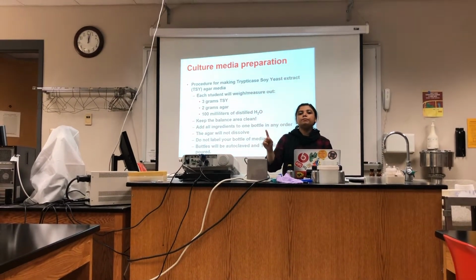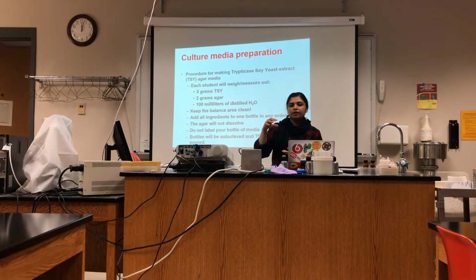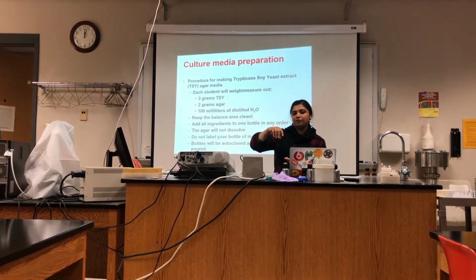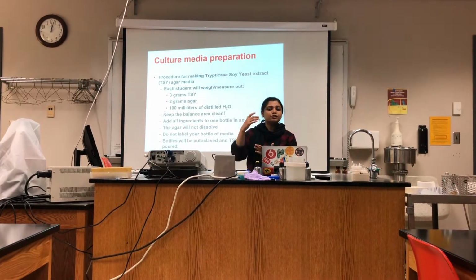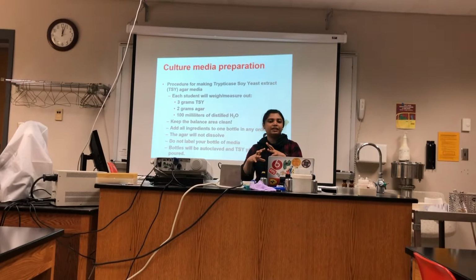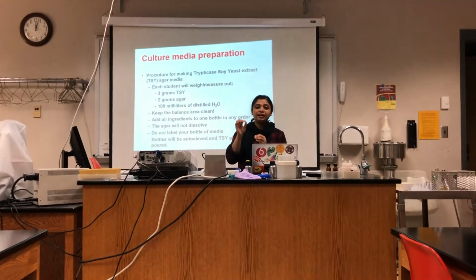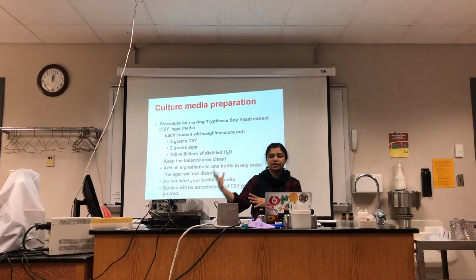One point you should be clear about with autoclaving is that we are not tightening the cap very well, because in autoclaving, pressure is built up in the bottle and it can just break. So you should be very careful to loosen the cap and then place it in the autoclave.